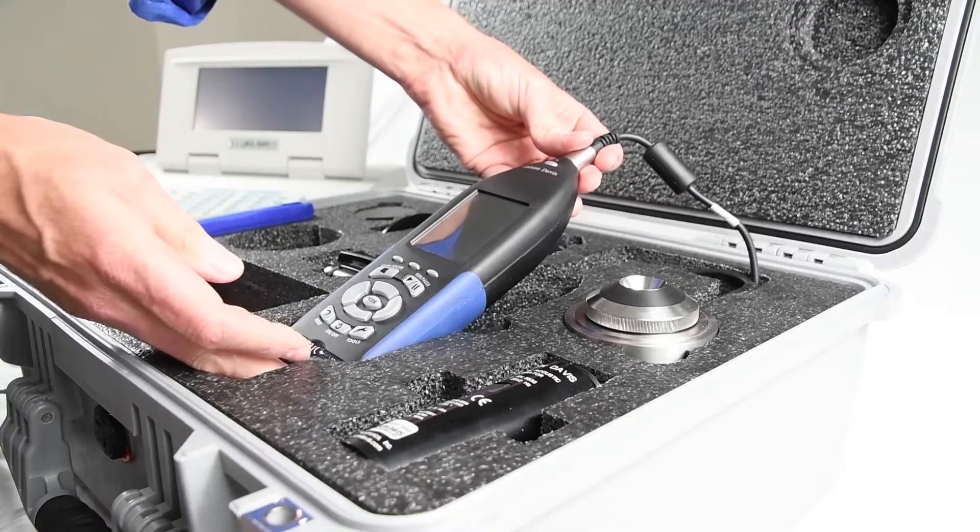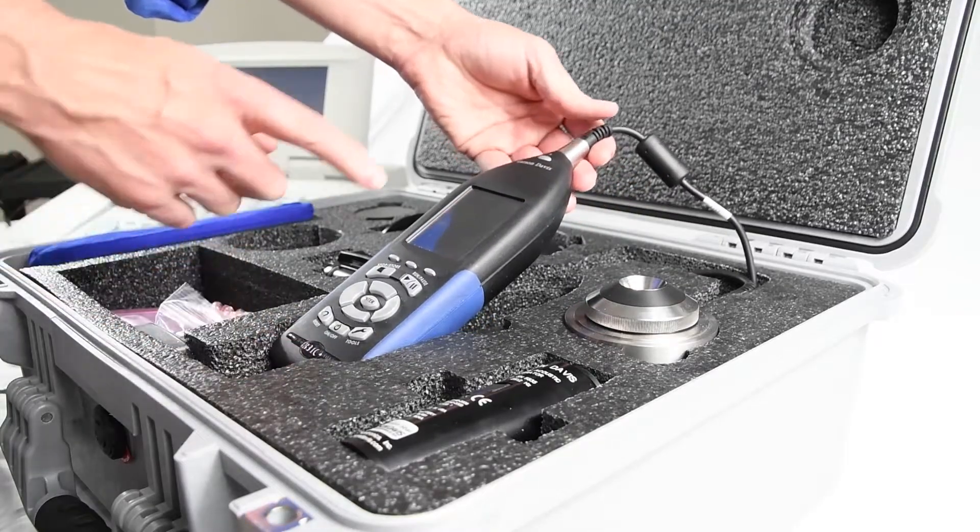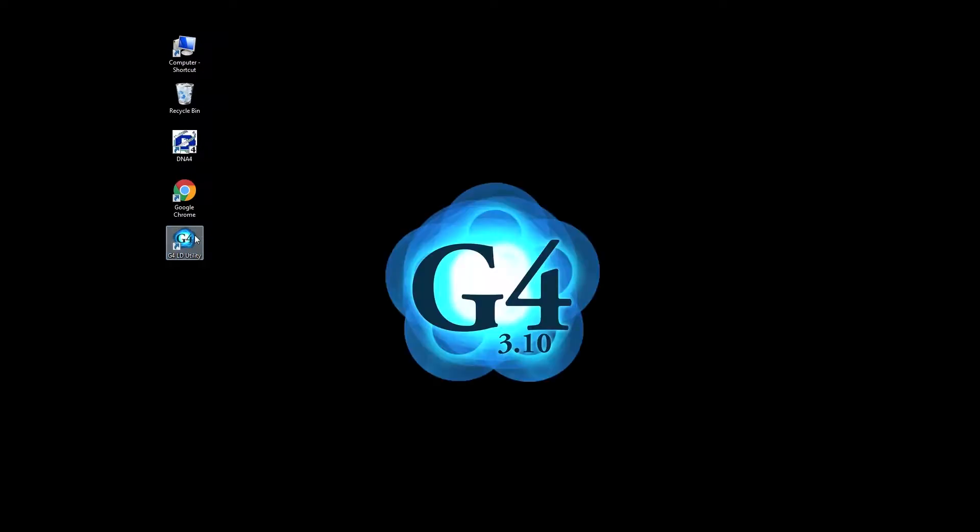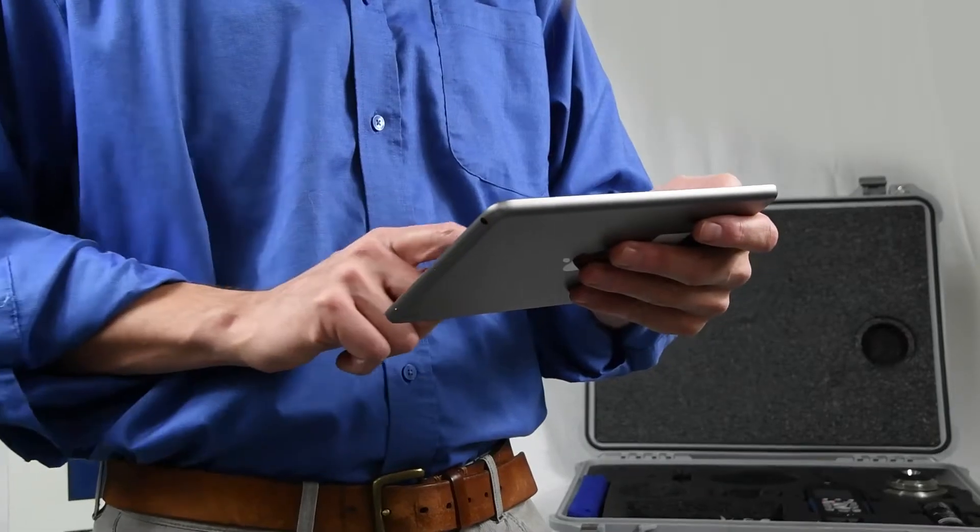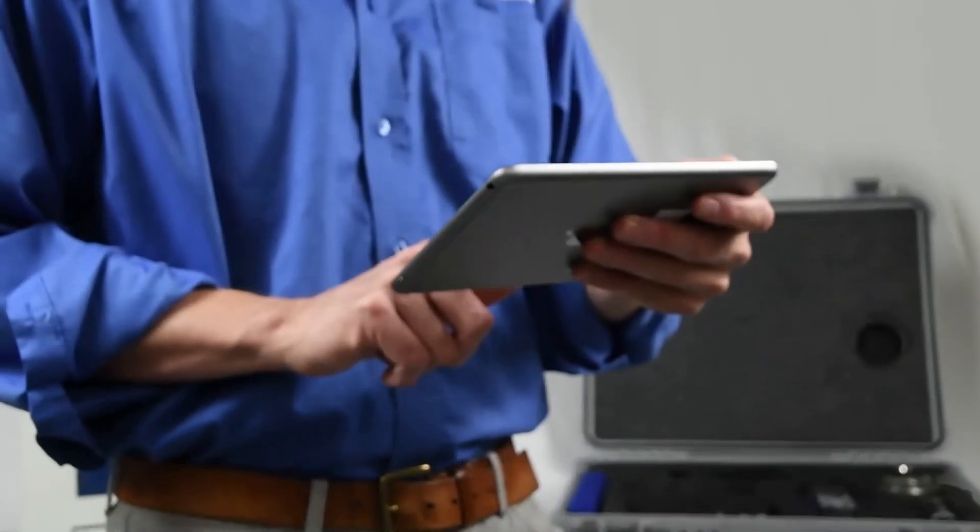The database is on the meter itself. You can access the database through G4-LD Utility PC software or using the AudCal app.